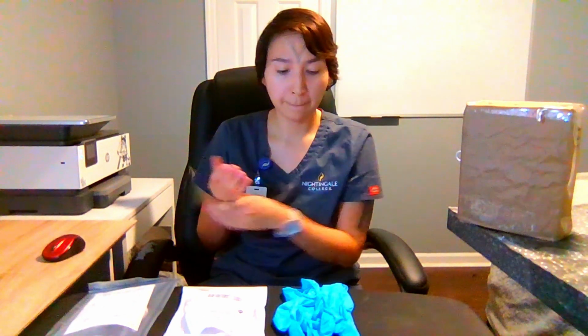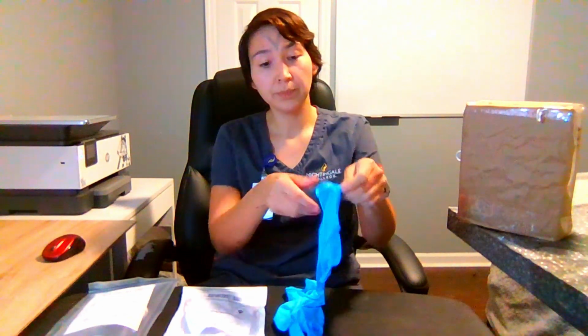To administer the medication, I will verify the provider's orders and perform the 6 rights of medication administration, which are right patient, right medication, right dose, right route, right time, and documentation. I'll verify the patient using 2 patient identifiers, perform patient privacy, verify any patient allergies, and verify the information in the patient's chart. I'll then perform hand hygiene and apply clean gloves.